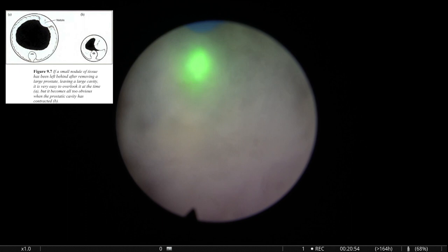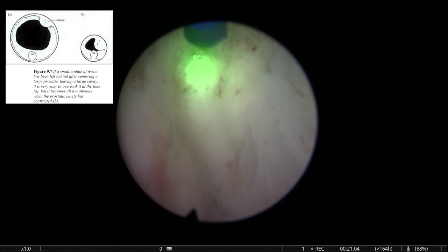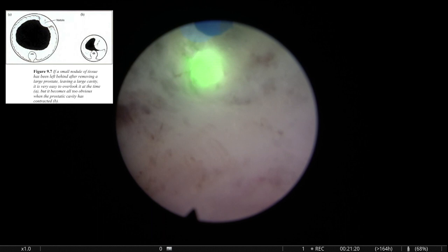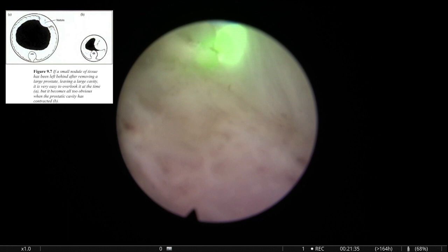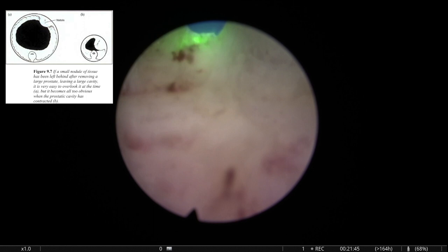So it was like an empty orange. And he painted a small adenomatous nodule left behind. So at the moment of the operation, the fossa is quite big, and this nodule only occupied a peripheral area. So there was a big cavity, and a small bump protruding into this cavity, which was the nodule. But then, several months after, he painted a much more collapsed prostate. And this small nodule, which didn't seem to be relevant right after TURP, became obstructive because the prostate had collapsed. The total volume of the prostate had been reduced, and then this nodule became more relevant and obstructive.